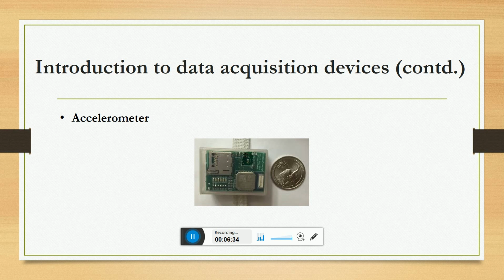It works within plus or minus 8 g for acceleration and plus or minus 1000 degrees per second for rotation. It has applications mostly in the rehabilitative field, where higher accuracy is not necessarily required. Human activity recognition, which has applications in various fields like healthcare, smart environments, and homeland security, can also be achieved by it. A pictorial view is represented in the figure shown here.